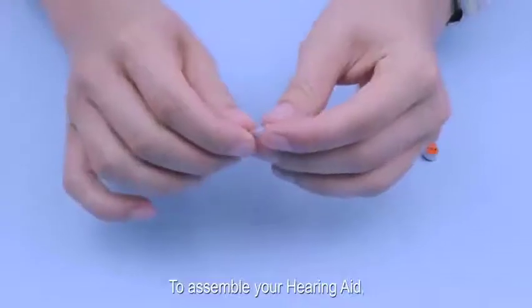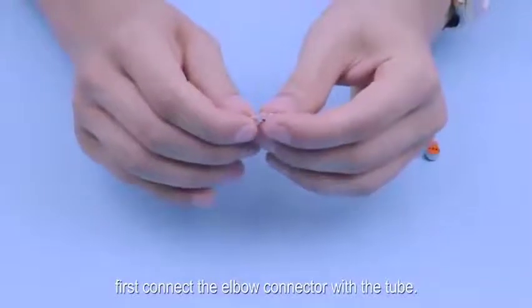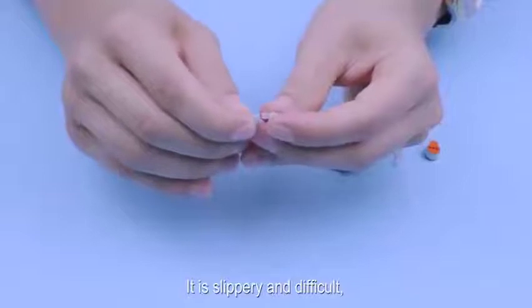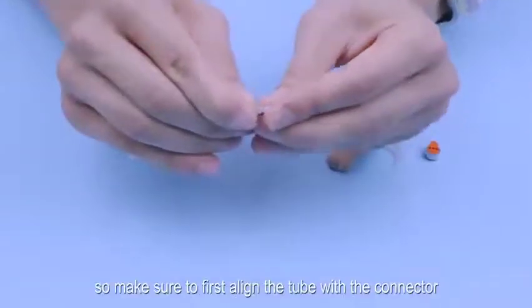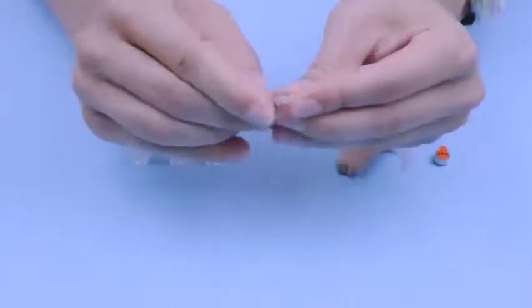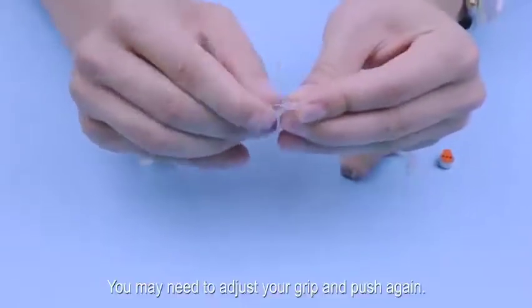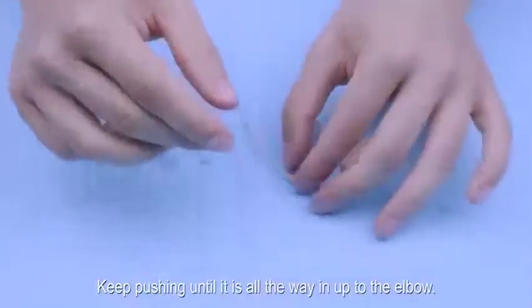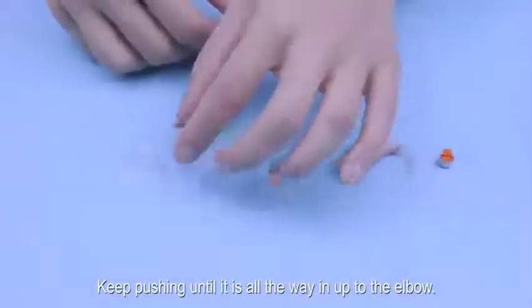To assemble your hearing aid, first connect the elbow connector with the tube. It is slippery and difficult, so make sure to first align the tube with the connector, then push firmly to put it on. You may need to adjust your grip and push again. Keep pushing until it is all the way in up to the elbow.